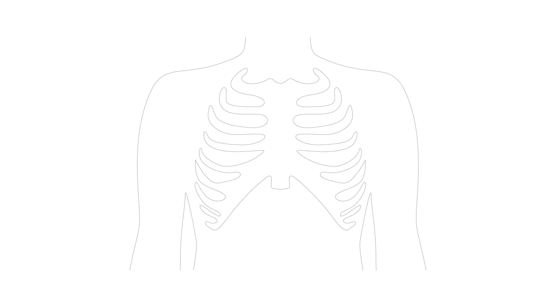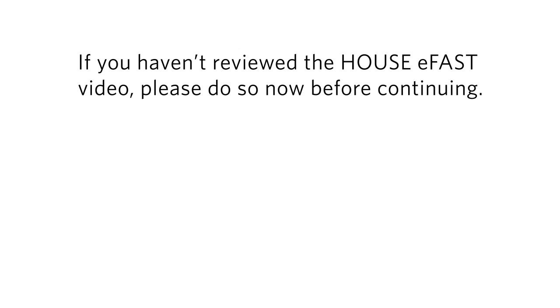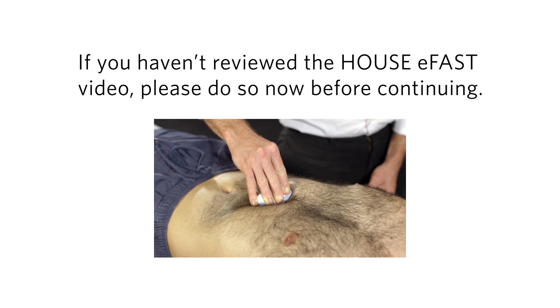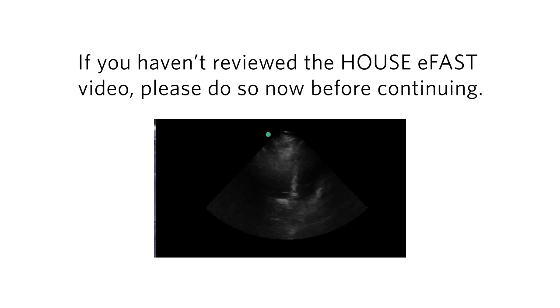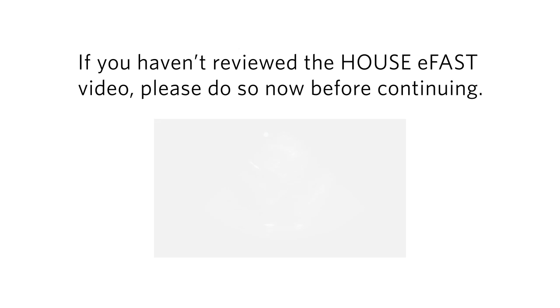This is a good order to acquire scanning competency as well, as the first exams are the most clinically useful. The subxiphoid view of the heart is also the first step in a FAST exam. This video assumes that you've covered this material and picks up after the subxiphoid scan has been completed.